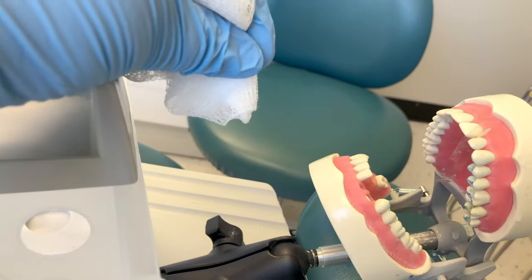It's a series of wipe, dip, wipe, and dip as they shape the composite. When they're satisfied, take the curing light and this time light cure for 20 seconds — the packable composite is thicker, so it takes longer for the light to penetrate to the deeper layers. Use your finger as a fulcrum to stabilize the curing light; wait for two beeps. There are different curing lights with more intense light, so follow your manufacturer's instructions for the equipment you are using.